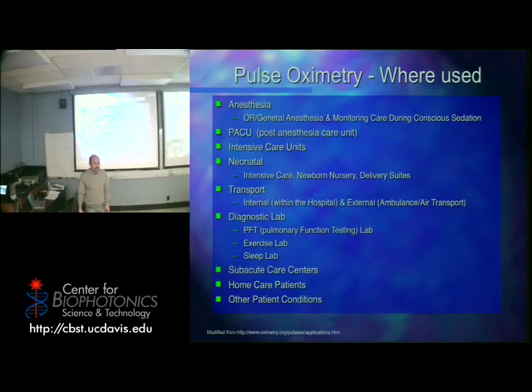It probably costs them, I mean, they're not even using a fiber optic there, they're just using electrical wires, which is even cheaper than a fiber optic. So I'm guessing it costs them less than a couple of dollars, but they're probably charging 10 to 15 to the hospital. Usually the charge to the hospital is usually 3 to 5 times what it costs to make for a medical device.